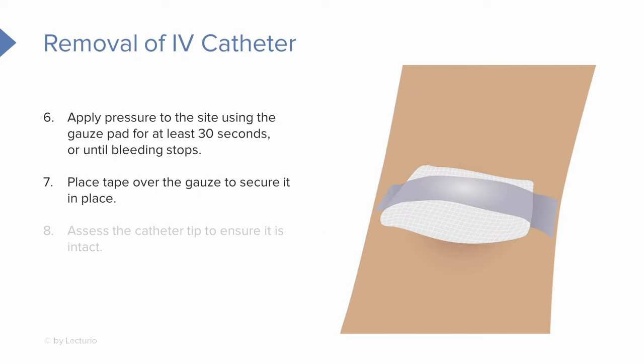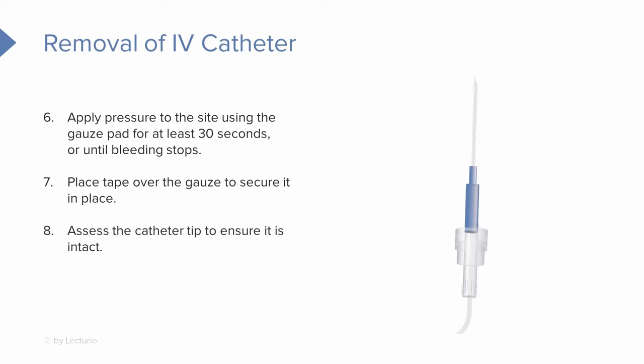Now that the bleeding has stopped, we can place tape over that to secure it in place for the patient. When we remove the equipment, make sure we take a look at the catheter and confirm the tip is still intact and everything looks okay.